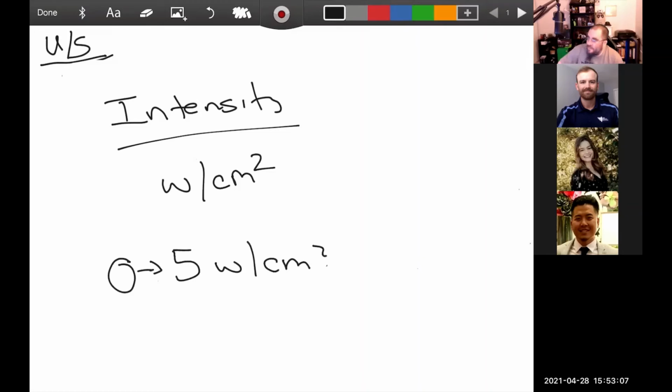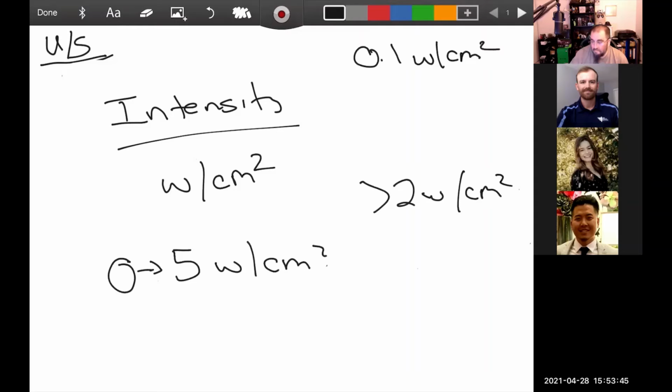I'm going to tell you, I have never, ever, ever in my entire career done an ultrasound over 2 watts per centimeter squared. Never. And I actually asked a couple of PTs, none of them have either. Because once you get over that 2 watts per centimeter squared, that ultrasound head gets pretty warm, and it gets a little uncomfortable. And I'm just not going to do that. The nice part about the intensity is it goes up in increments of 0.1 watts per centimeter squared. So you can do something like 3.2.